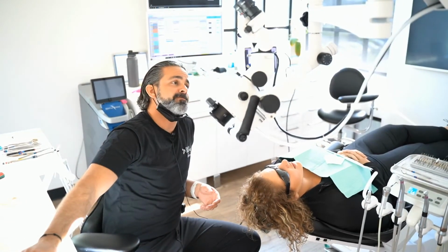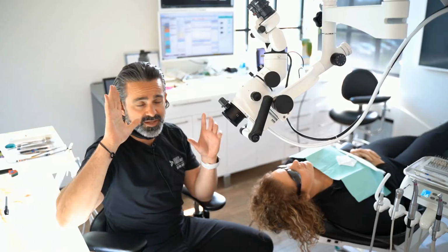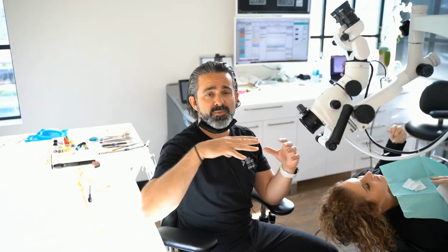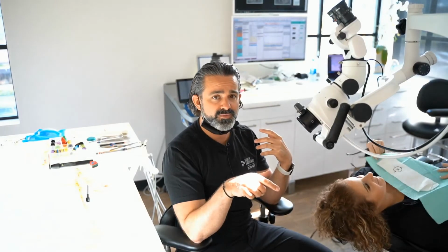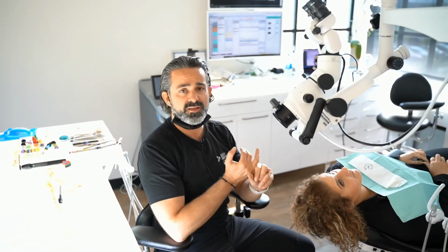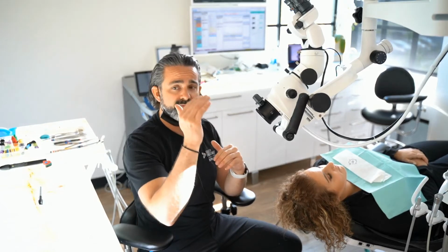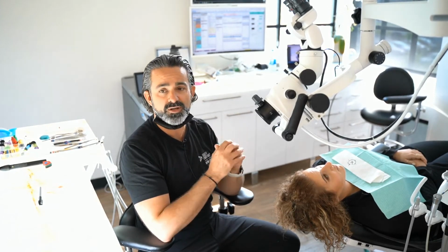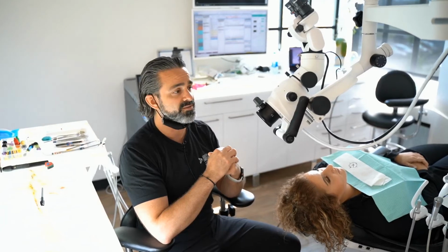I'm trying to think if I've missed everything. We've talked about position and mounts. Number one, I think the most important mind frame is to look at your room and figure out your ergonomics, where you want your microscope mounted. Think about how you and your patients walk in and out of the room, and think in terms of vibration: whether you're upper level, lower level or ground level, and where your mechanical equipment is. It sounds crazy, but it is so important. From a guy who's done it for 15 years and built 4 offices, it's the thing you want dialed in.